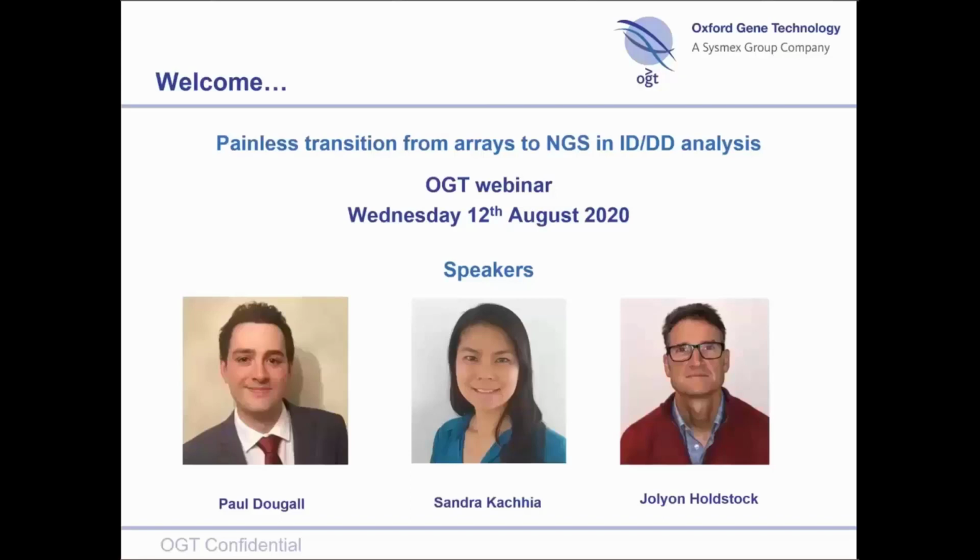So not only do we have the 700 IDDD genes at the exon level, we also have this larger range of genes at the gene level, which allows us to call and pick up larger CNVs across the genome, but just a slightly lessened resolution than the targeted genes. So yes, you can definitely pick up other regions with this kit.